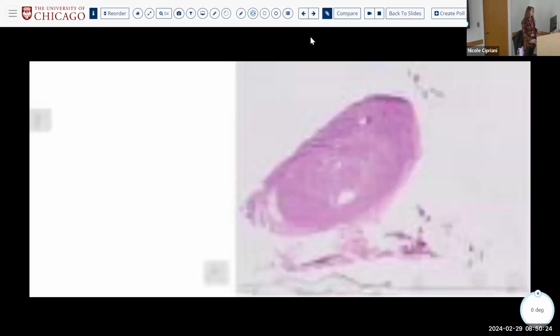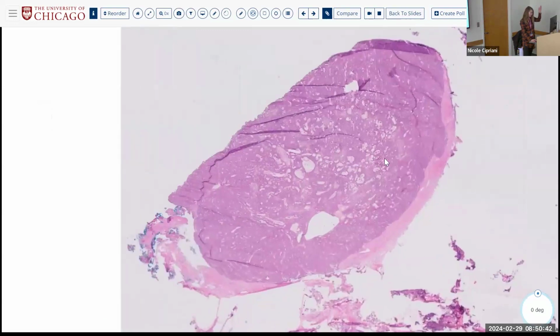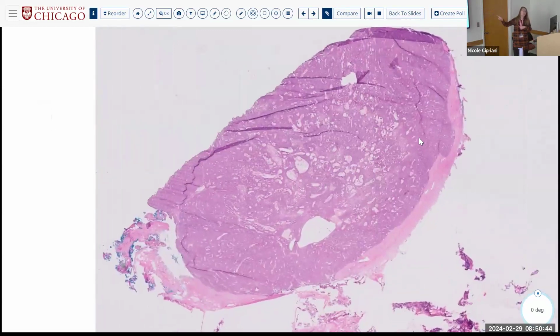So here's a resection. And this was called low-grade biphasic salivary neoplasm, whatever, favor basal cell adenoma. And they still did a frozen, which eventually was useless because it was the same diagnosis that we suggested on core. But when you see salivary neoplasms for frozen, I'm trying to get them to stop doing them unless the differential is adenoid cystic. In this case, they did it anyway.